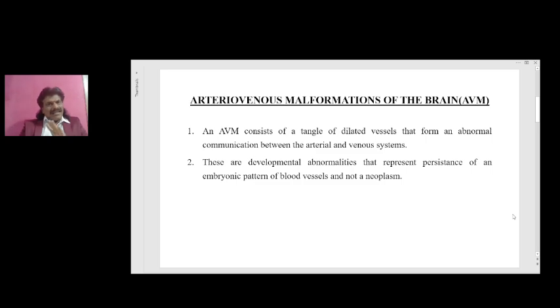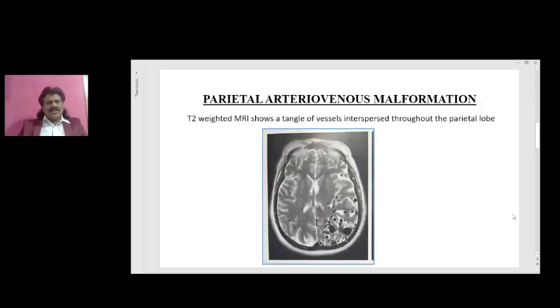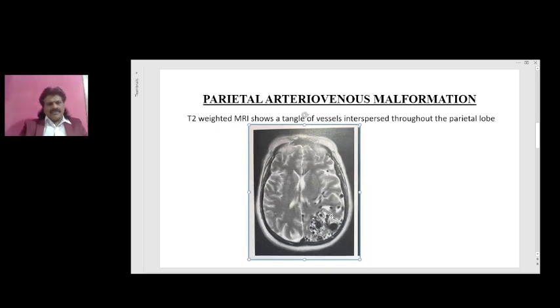If you see this imaging you will be able to appreciate better. This is a T2-weighted MRI — T2 because the CSF is white in color — and this is the parietal area. So this is a parietal arteriovenous malformation. The T2-weighted MRI shows a tangle of vessels interspersed throughout the parietal lobe. If you find this kind of abnormality, you should suspect arteriovenous malformation.